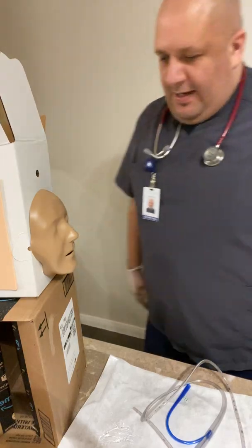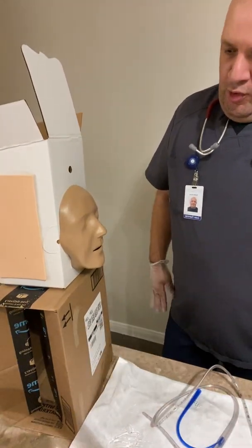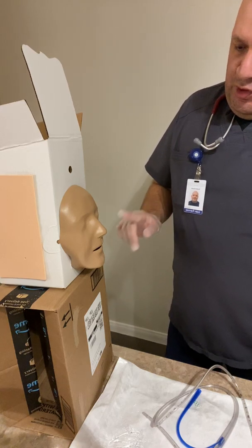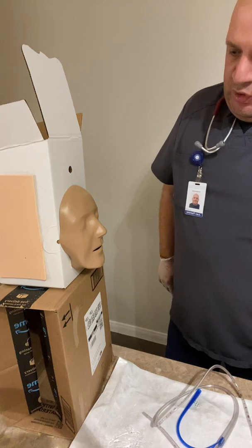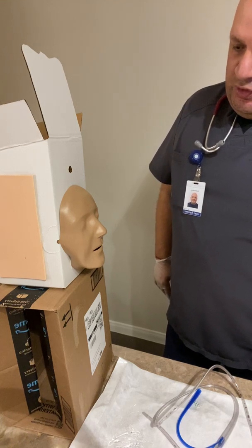Okay. Hi there, my name is Juan. I'm going to be your nurse today. The doctor ordered a NG tube. It's a tube that's going to go through your nose to your stomach to deliver some nourishment. Is that okay to do?